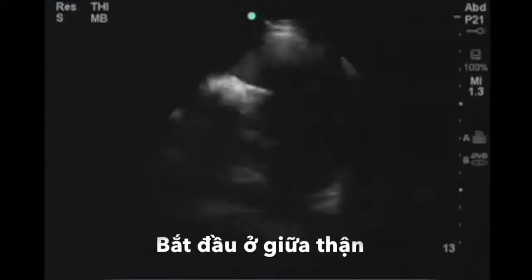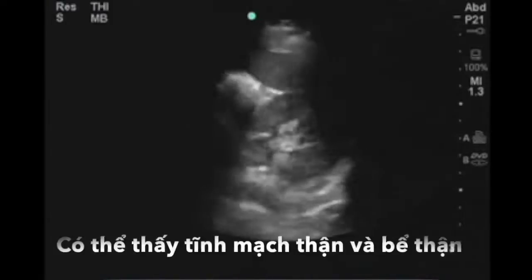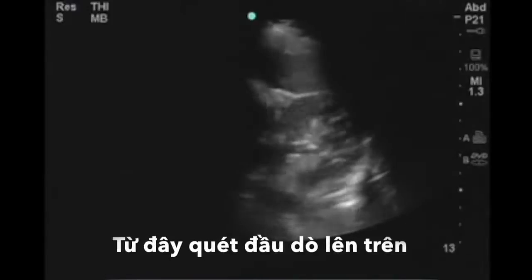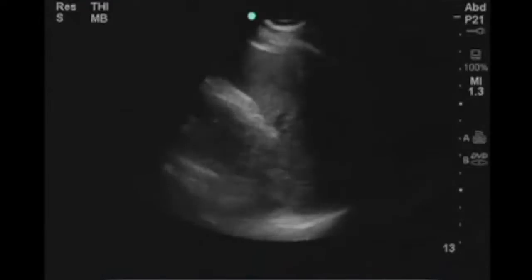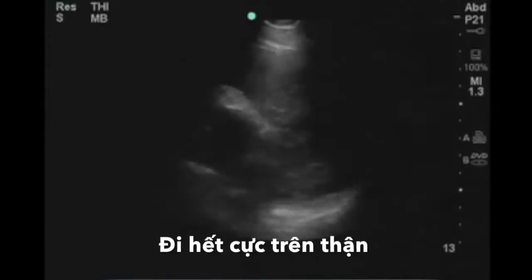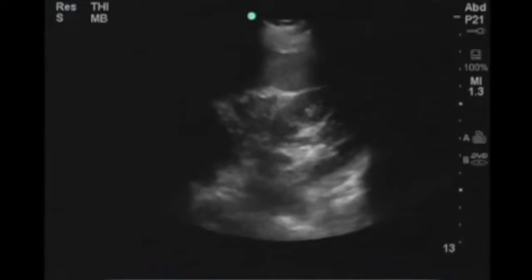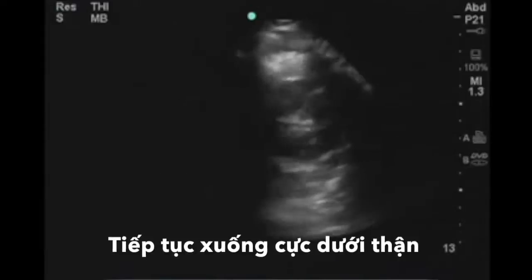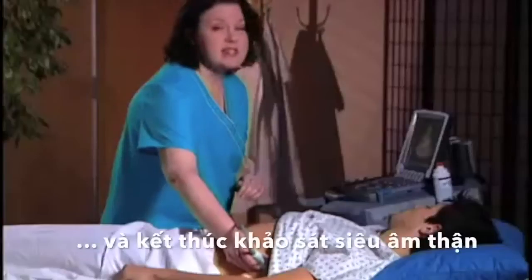If I start at a mid-level, I will see the renal vein entering the pelvis of the kidney. From here, this is my midpoint, I'm going to sweep superior. I might have to go up a rib space to find it. Go all the way through the kidney, superior pole, and then start to move inferiorly to mid-level. Continue on down, inferior again, to the lower pole of the kidney, and all the way out. So that completes the kidney evaluation.